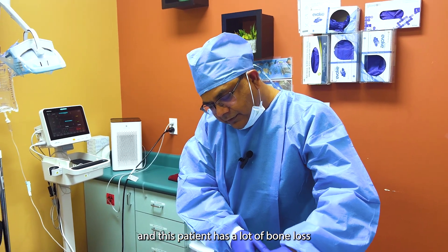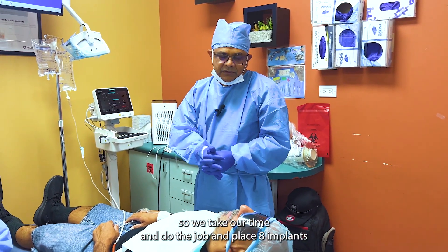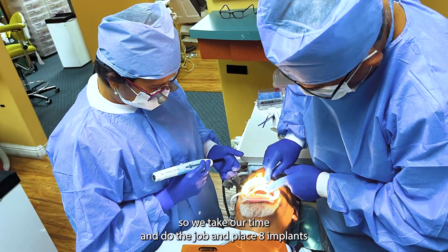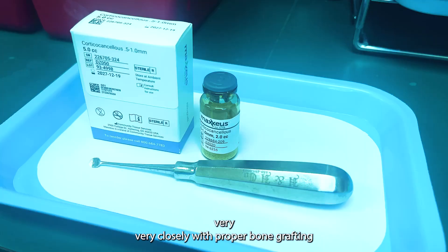This patient has a lot of bone loss, so he will need sinus bone grafting and a lot of other procedures. So we take our time and do the job and place eight implants very meticulously with proper bone grafting.